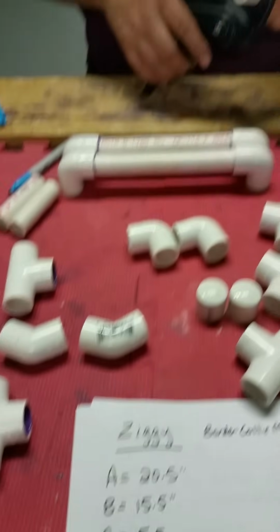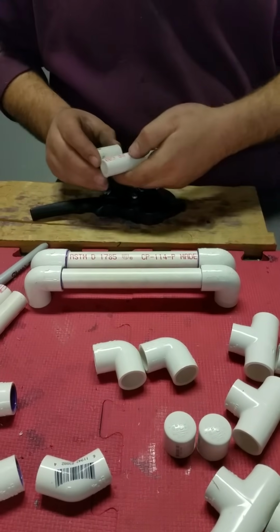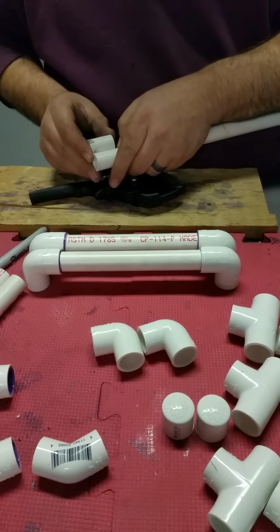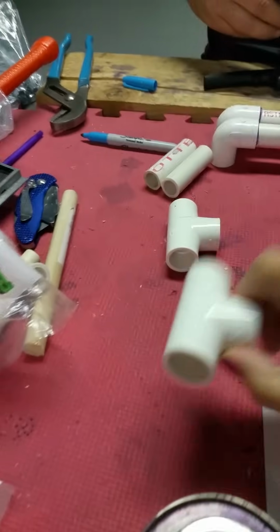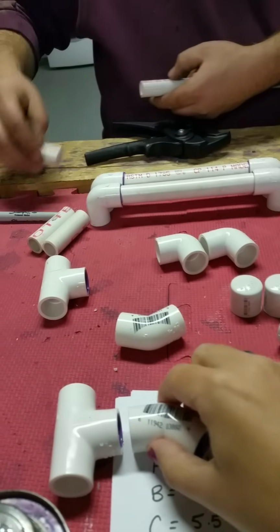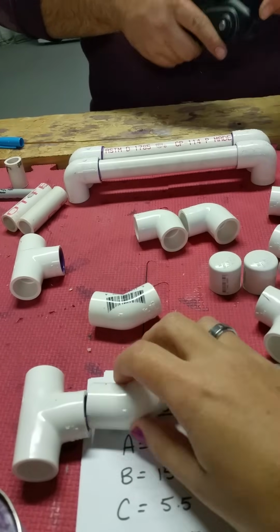Between 1 1/4 inch. We also cut 2 pieces that are 1 inch and 3/8. These are going to be the pieces that are going to hold together these 2 pieces. They go inside. You won't see that piece, but it's going to be the connector that holds this together, and this is going to drop down to make the leg.